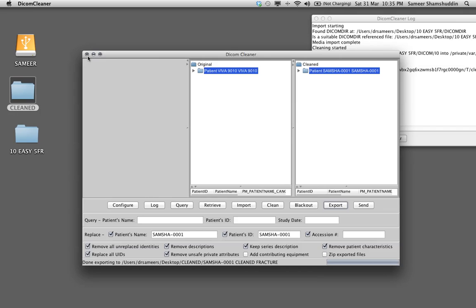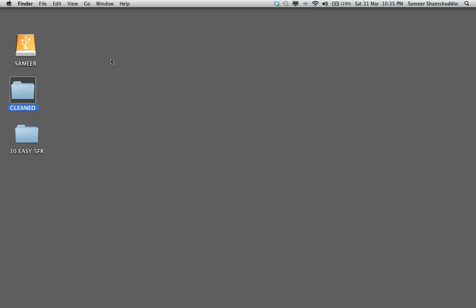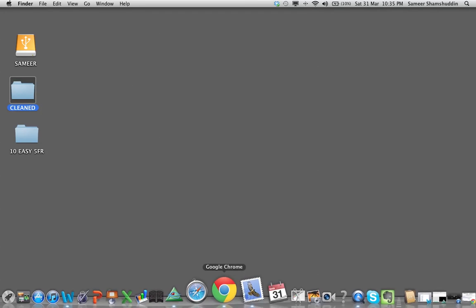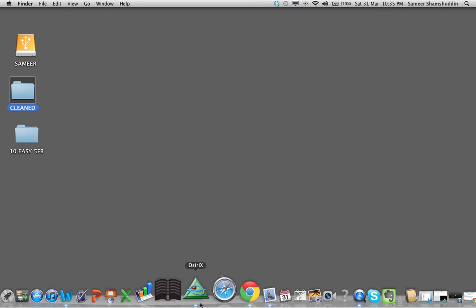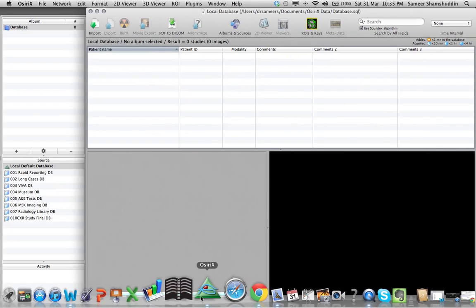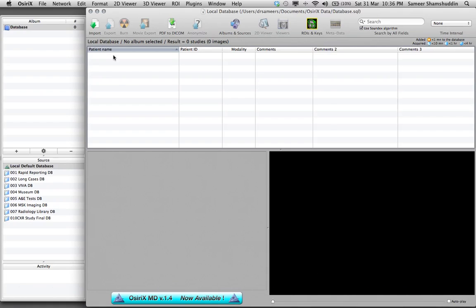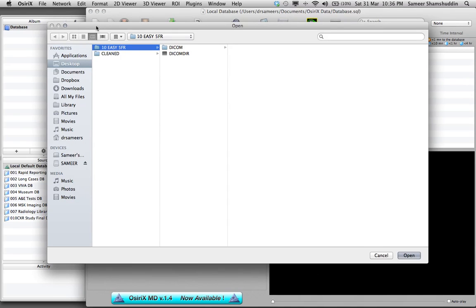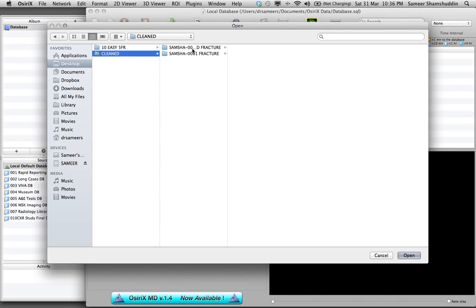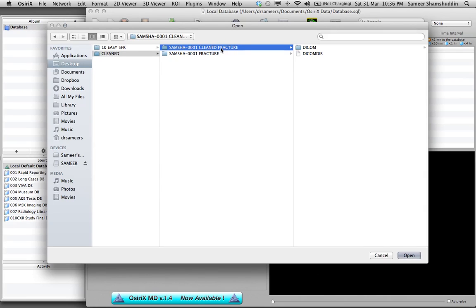Let us see has this worked. Let us close the DICOM cleaner and launch OsiriX. Now to get the case onto the OsiriX, very simple, click on import, desktop, cleaned.